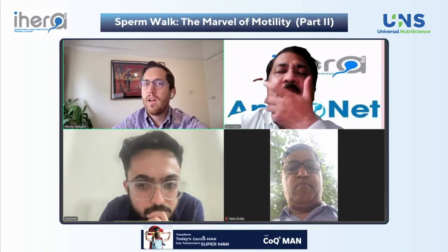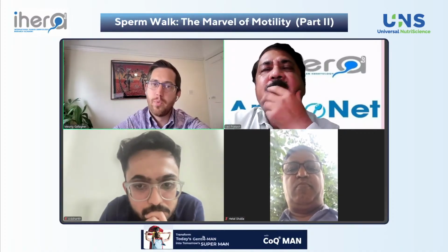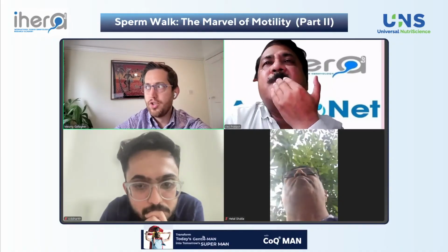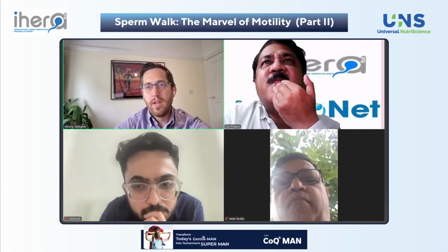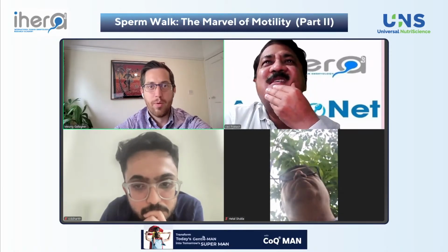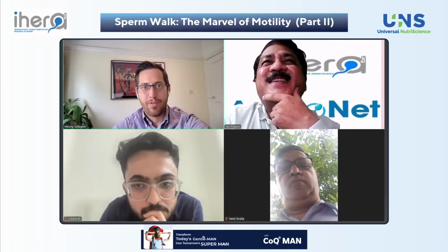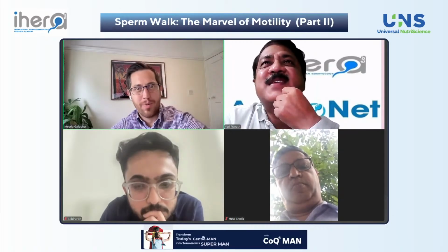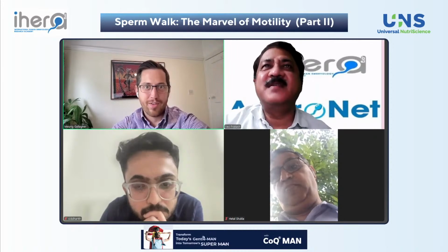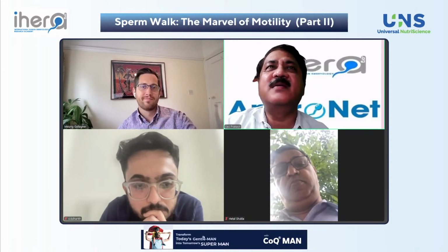So, definitely. And yeah, I think that also goes back to what I said at the start about yield. With a lot of these preparations, we've done some work on microfluidic preparation, and when people talk about microfluidic devices, their first question is, will I get enough sperm through? And actually that's not the question. The question is, will I get the right sperm through? If I only have 10 sperm, but those are the 10 sperm that would make it in natural fertilization, then you can take those 10 and inject them all into eggs. Yes, you're right. Absolutely right.